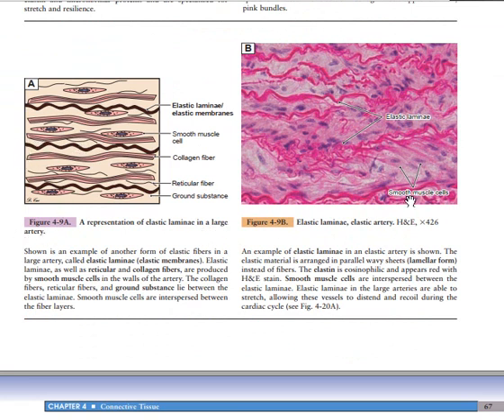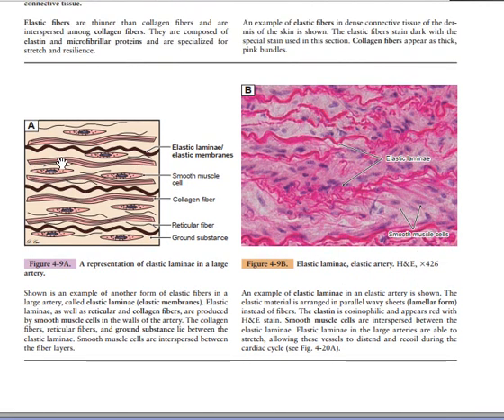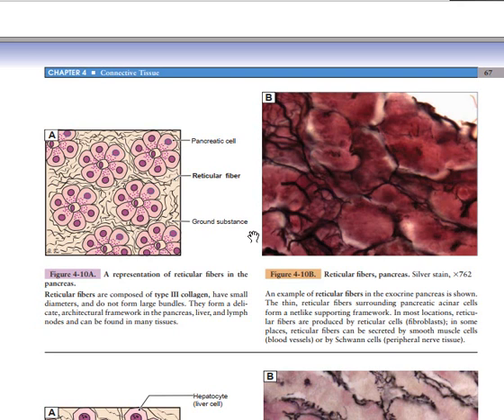Now see here you are using a hematoxylin and eosin stain. So you have collagen in the diagrammatic representation here. Here you have collagen fiber, and you have elastic laminae. So these are elastic laminae. You see that in the large arteries, elastic fibers are arranged in laminae such that they can be used in reducing the expansile strength, as you can see.